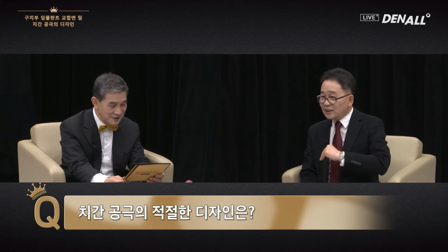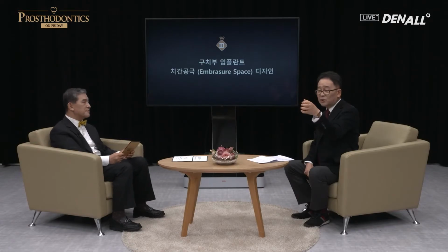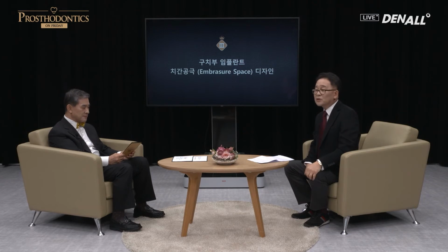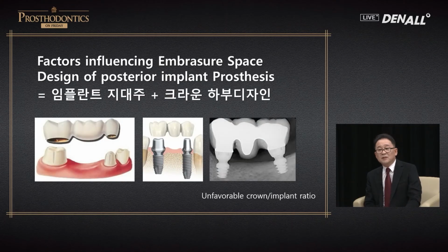Let me briefly touch upon embrasure space before I talk about it. If the implant is appropriately placed with appropriate thickness and in the right position, the design of embrasure or occlusion can go pretty easily, but it's easier said than done. The embrasure space is influenced by the implant abutment and how you design the bottom part of a crown.